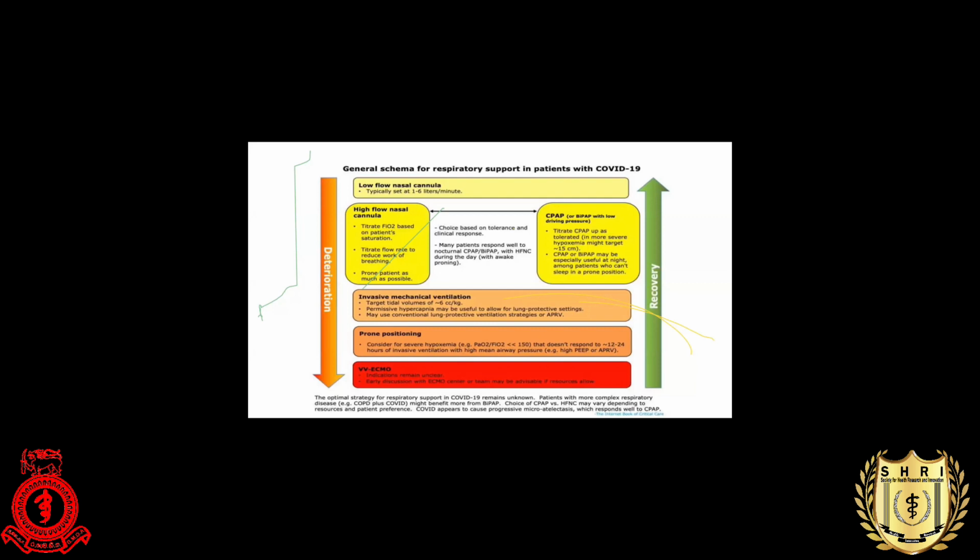What are the changes when applying HFNC to pediatric patients? In the pediatric patient, the only thing is that there are specific high flow nasal devices. You can't use the adult one. You also have to use a pediatric nasal cannula. You can go up to 2 liters per kg, which is the maximum level. You can start with 1 liter per minute per kg, and if the patient is deteriorating, then go to the maximum of 2 liters per kg per minute. If the patient is further deteriorating, then you have to select intubation or do something else, because that means high flow nasal oxygen will not work for that patient anymore.